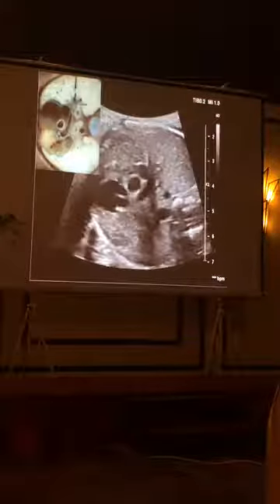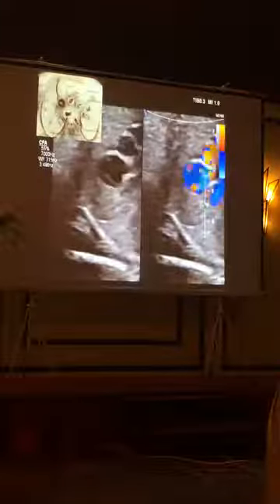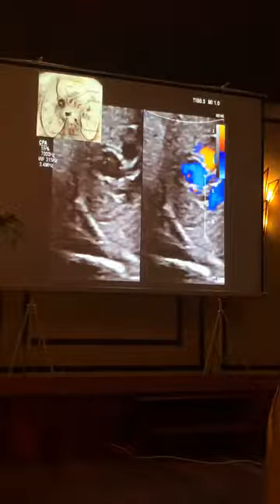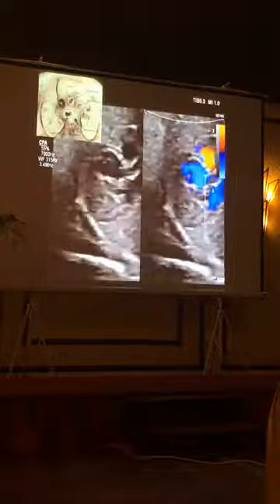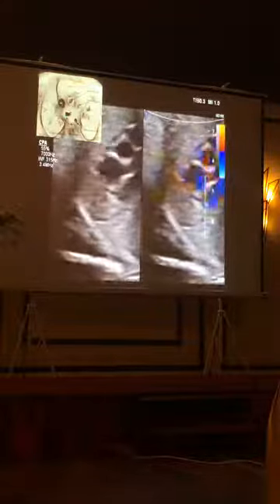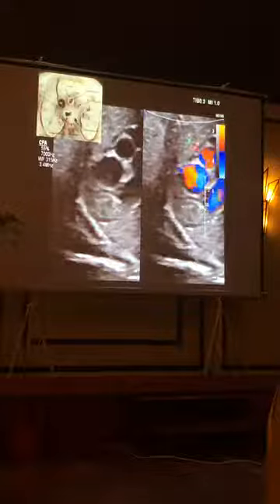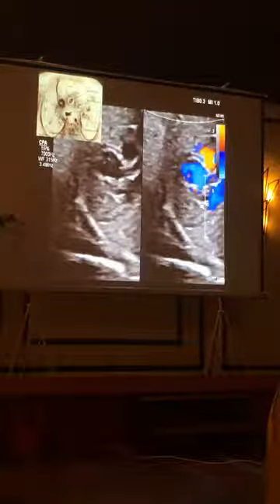And this is, again, depending on the position of your transducer, because if you tilt it more like an oblique plane and cut three vessels in this way, as is presented here, you see three circles: pulmonary trunk, aorta, and superior vena cava, and again it's normal. It just depends on what you are doing.